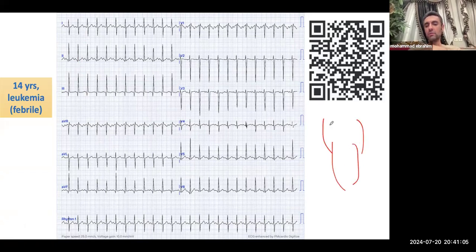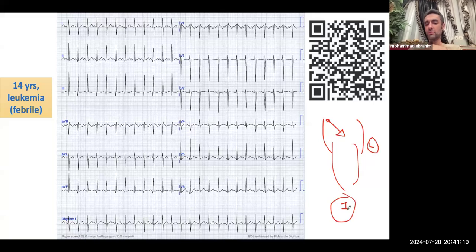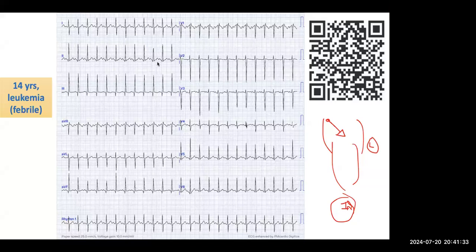Okay, guys, so where's your sinus node? Somewhere here, right? The direction of your atrial activation is towards the left, and towards your inferior leads. Understood, guys? I believe this is very simple, so I imagine most people are understanding this. Right, guys? Questions?